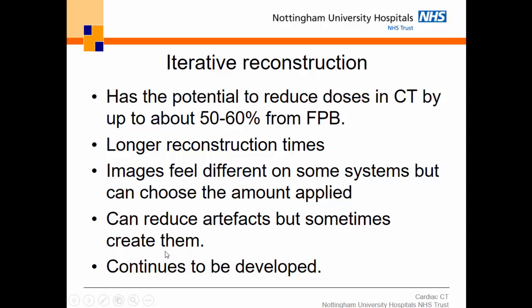The texture's different. Now everybody thinks, well, it's different, so it's wrong. Actually, filtered back projection introduces texture and noise that isn't real in the patient either. Do you know what I mean? It's just the choice of which one is the most wrong. No imaging system perfectly represents the patient. So if you're going to try them, work out how much you're going to use, and work out whether the images are diagnostic, whether they're accurate or not.